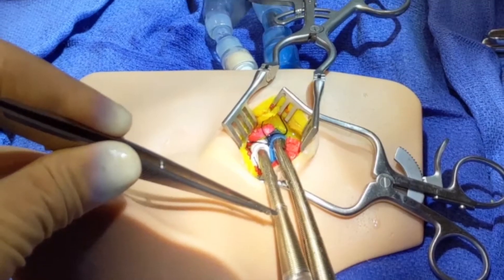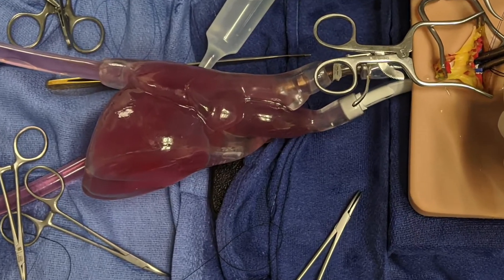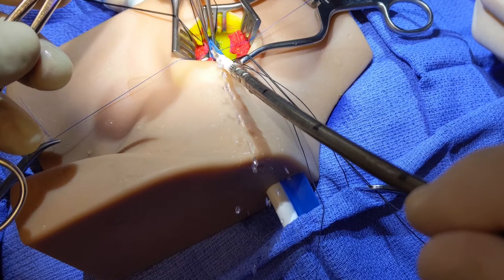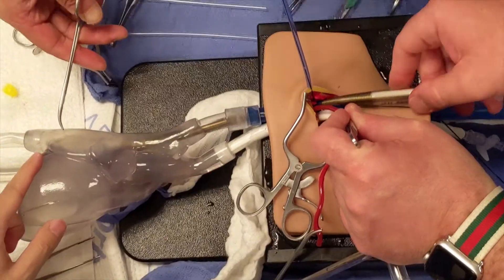The heart is reusable. It is transparent to allow for visualization during cannulation and is also closed-loop connected to a saline bag to provide realistic bleed back, so a pulsating pump is not needed.